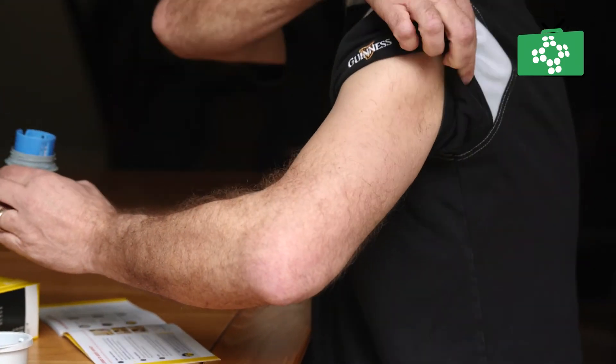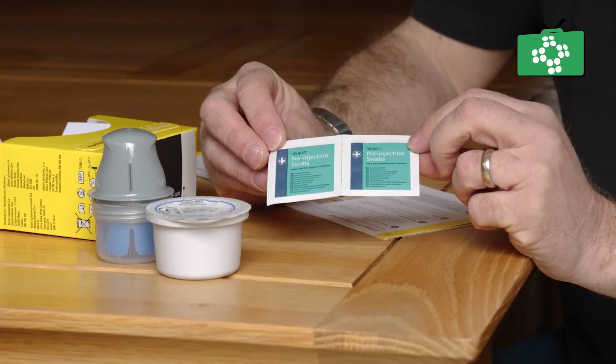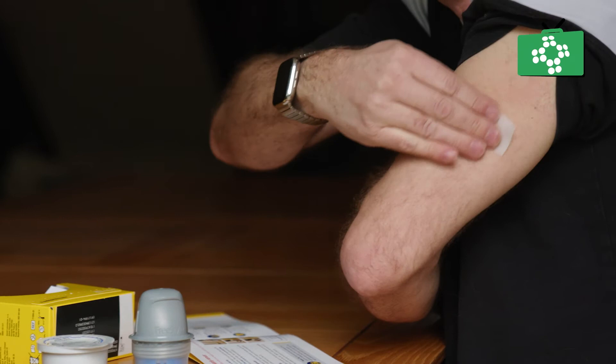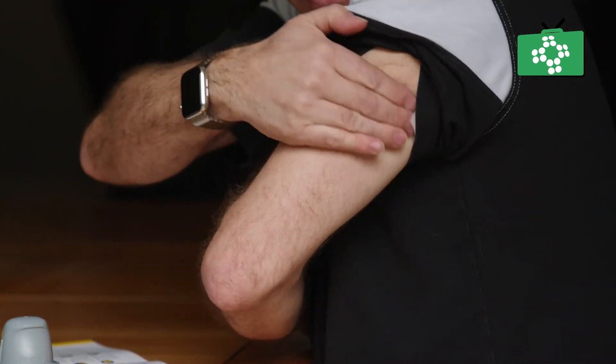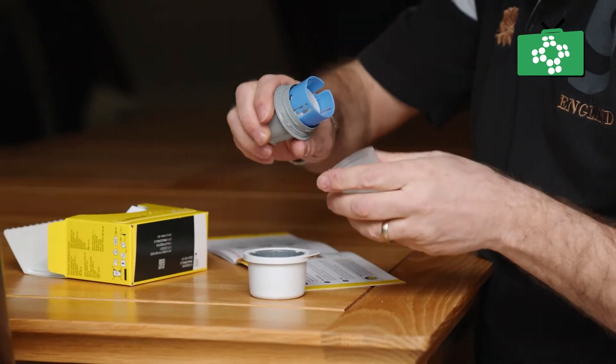Select the site at the back of your upper arm. Avoid scars, moles, stretch marks, or injection sites. Wipe the site using the moist wipe provided in the pack.